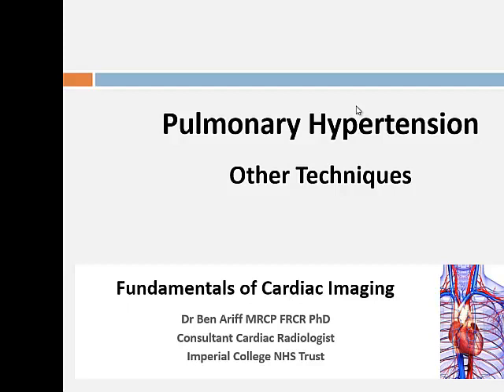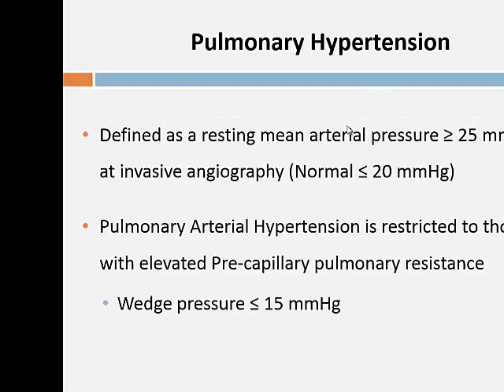Hopefully that will show some relevance to all of you, because cases that come to tertiary centres don't start in tertiary centres. So the point is, you are often going to be the first line of picking up these pathologies, and if you come to a tertiary centre you need to be familiar with the line of investigations and also what the tests are there for and what they're trying to show.